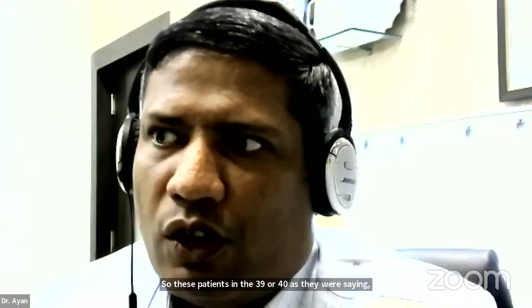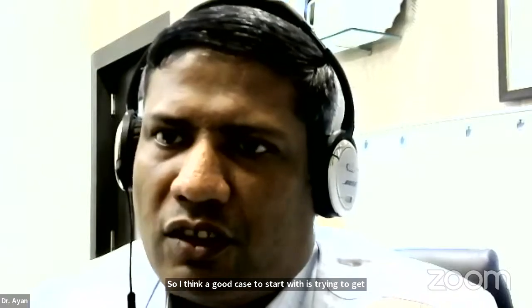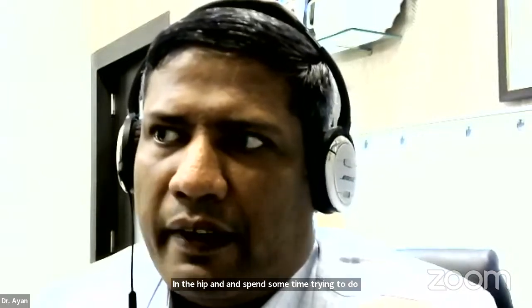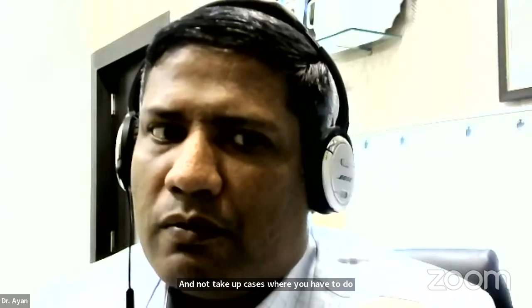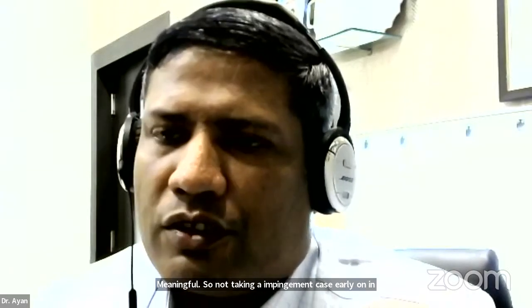I think a good case to start with, to get used to hip arthroscopy, is a joint lavage case, or taking a synovial biopsy, where you can spend some time moving around in the hip, and not take up cases where you have to do something meaningful. So not taking an impingement case early on when starting hip arthroscopy.